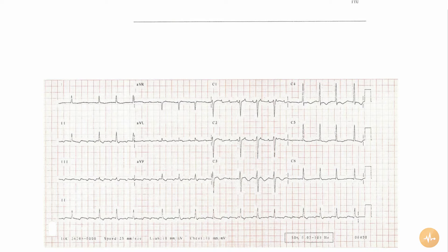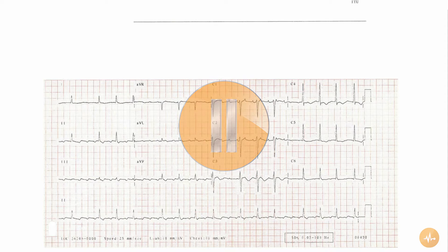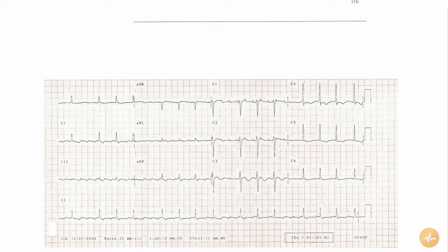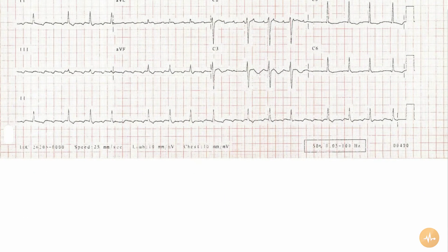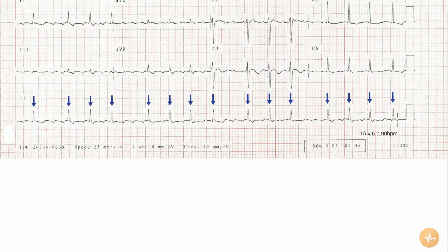This is an ECG recorded from a patient complaining of chest pain. Pause this recording now, interpret the ECG on your own and then press play again to hear me interpret the ECG. The rate is 90 beats per minute.